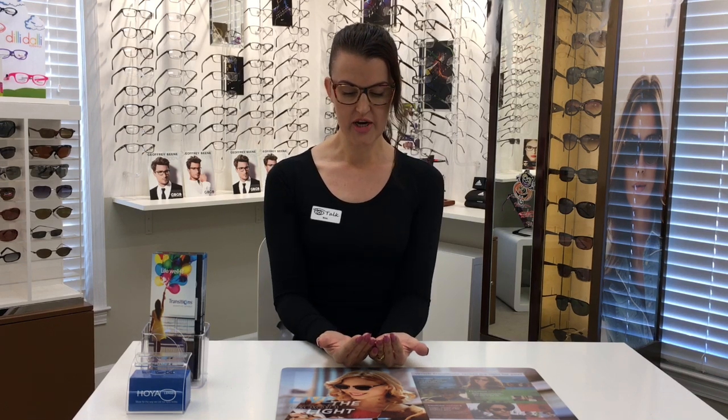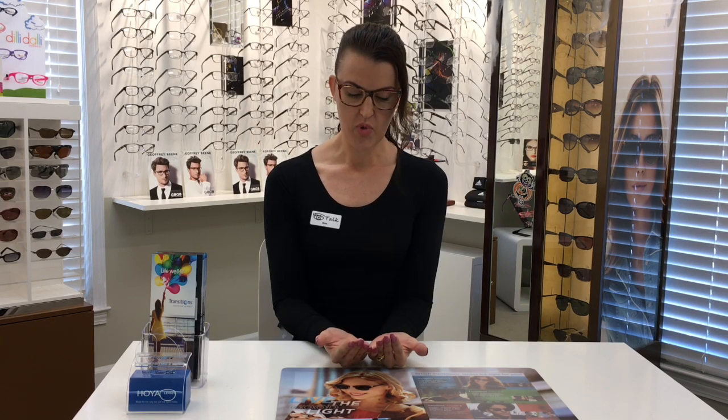Now you want to look at something up close. Take something with small print and put it at normal reading distance — in the old days you would have read a newspaper. Focus on one part of the text and make sure you're facing it straight on, then tilt your chin a little bit up and a little bit down to find that sweet spot. If you're getting clarity at one position of your jaw, that means your reading distance is working.